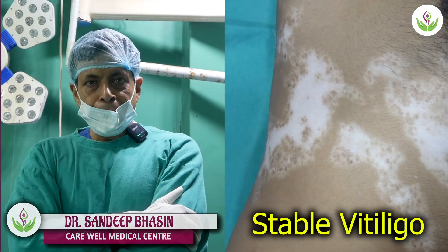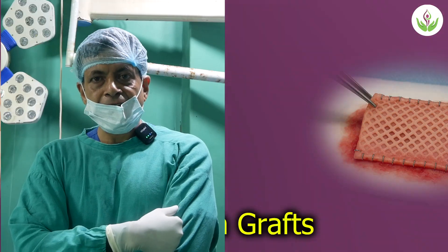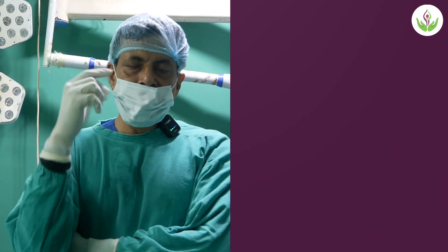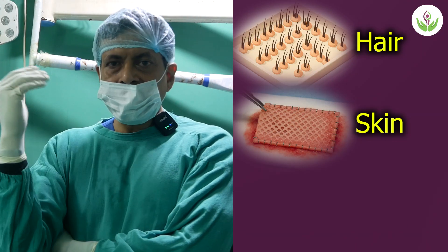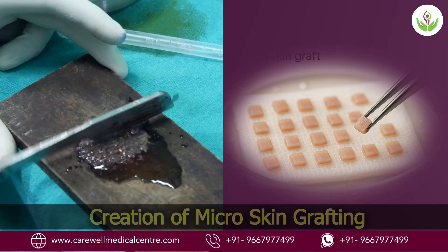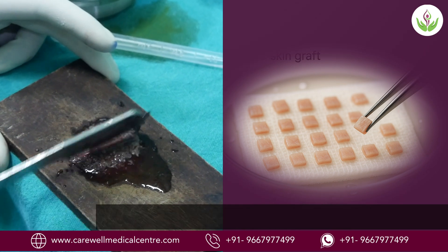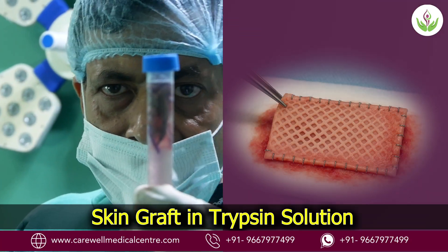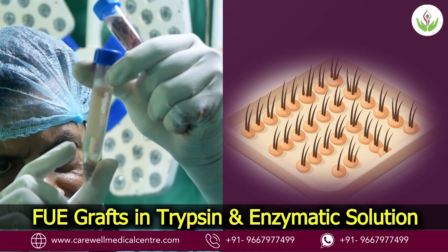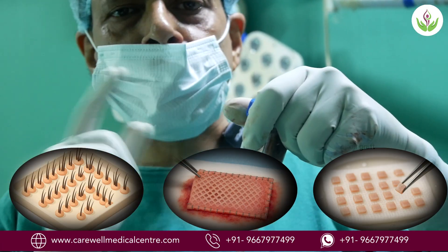We'll be using three things: a follicular graft from the hair, micro skin graft, and a skin graft for melanocyte transplantation. So there are three different sources — one from the hair, one from the skin graft, and the third is the micro skin graft. This is micro skin grafting; we are creating micro skin grafts using this technique. The skin graft has been taken and placed in a trypsin enzymatic solution along with follicular stem cells and grafts from the hair. We are doing all three techniques together in this patient.